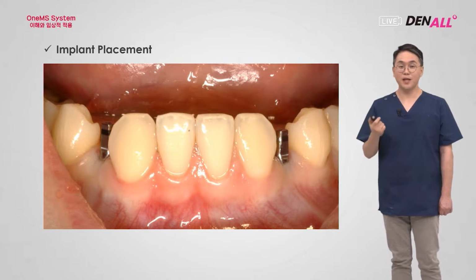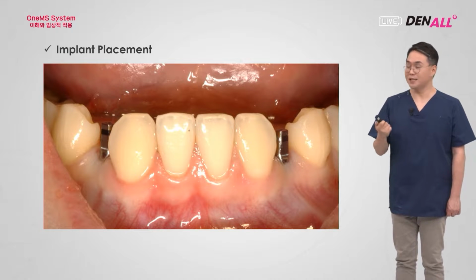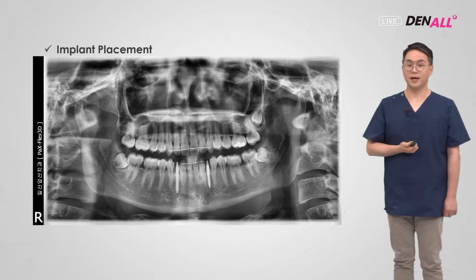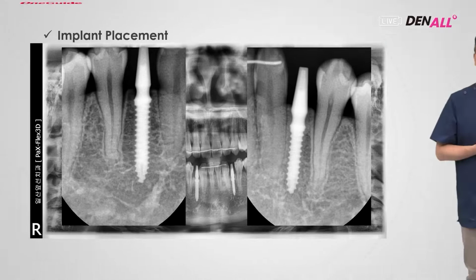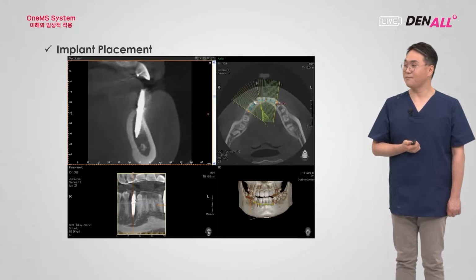And one more thing, as I said, when you order from the digital center, you could also order temporaries. So the prefabricated temporary crown was set. This is the post-op panorama and PA, and as you can see, the mesial-distal distance was very limited, but the implant was placed okay. If you just open the gingiva and place the implant, could that be the result? You would have to take X-rays and other very complicated steps would have been required.